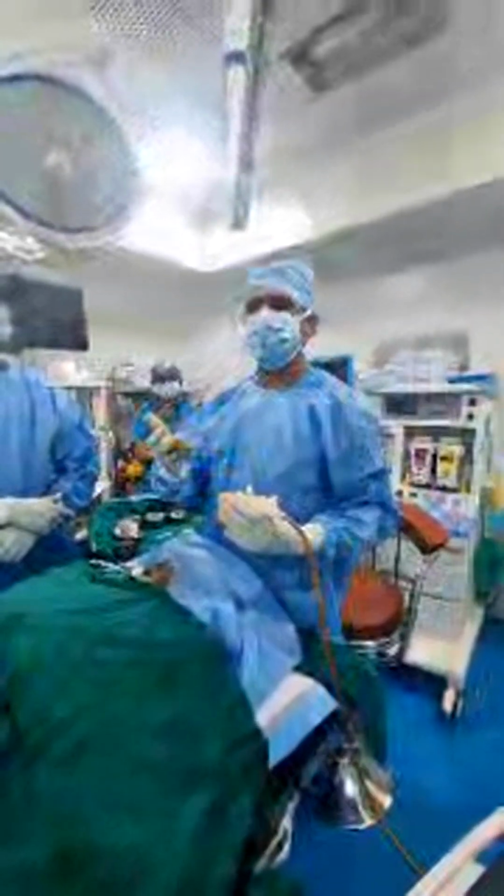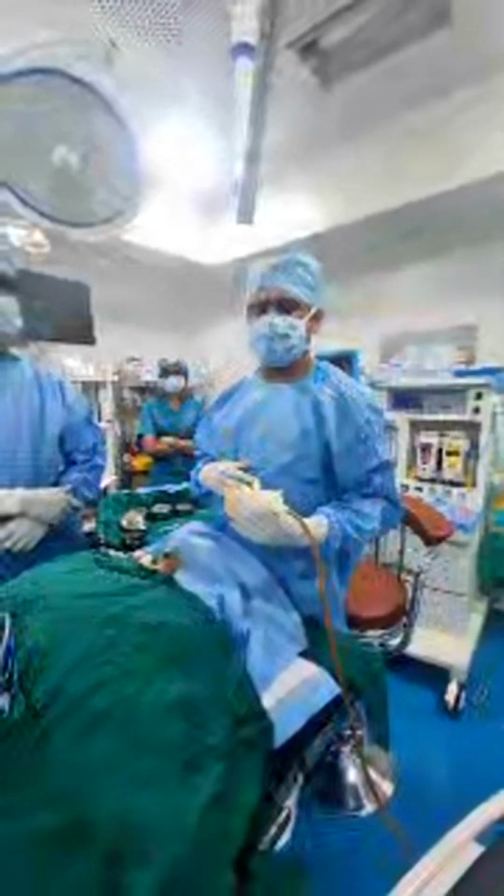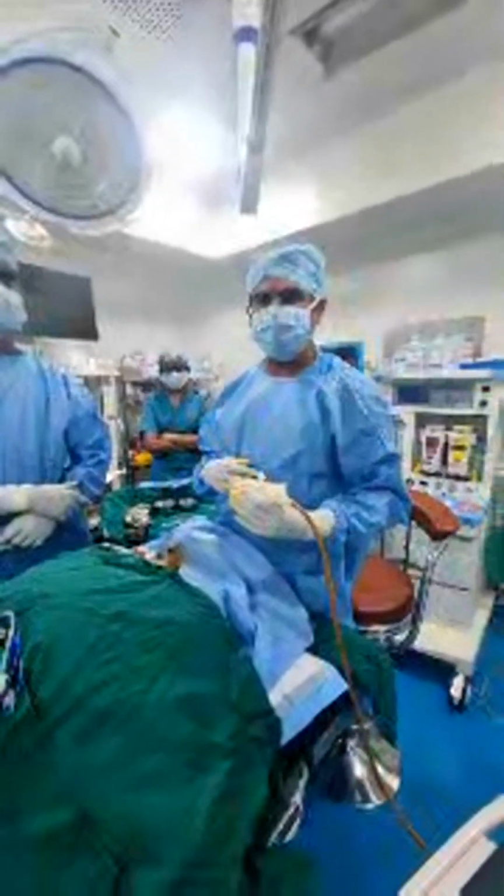That is the beauty, wherein the patient can walk and go home. So it's an OPD procedure, but it has to be done under sterile conditions, in a comfortable way, and the results are amazing. Next we have posted many times how the pre and post results look, complete resolution and absolute 100% patient comfort and satisfaction.